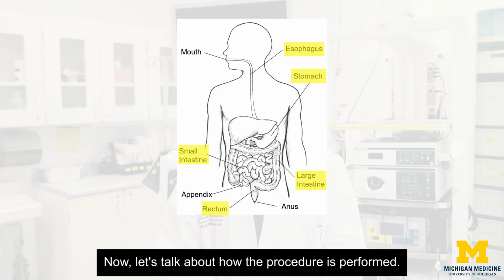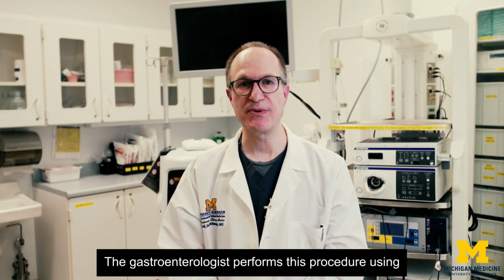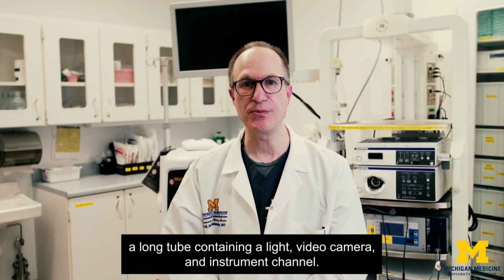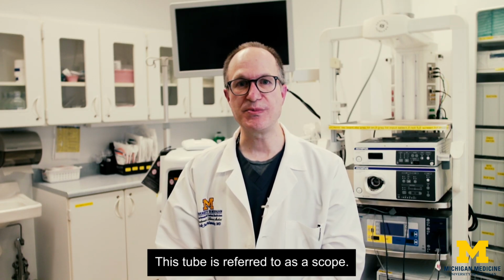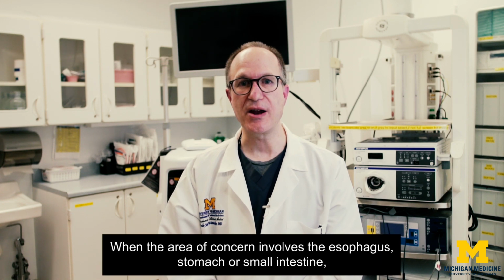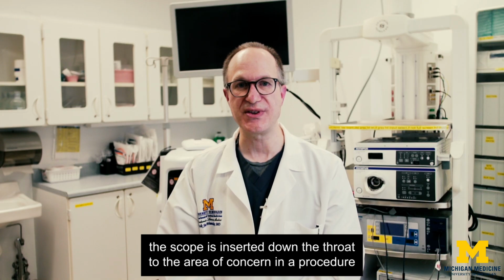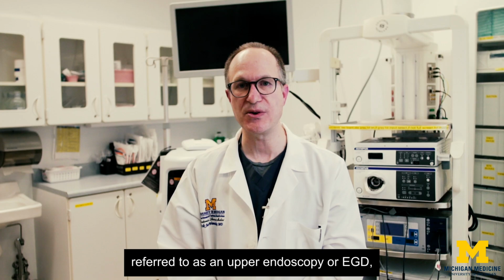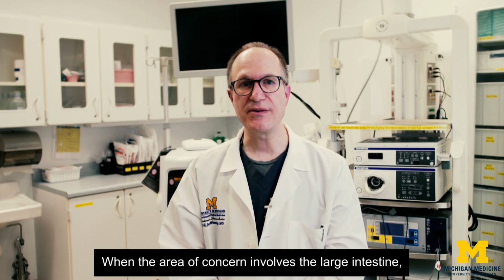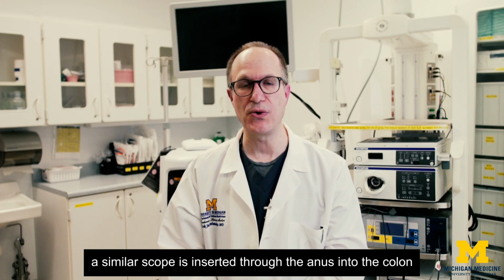Now let's talk about how the procedure is performed. Depending on the location of concern, the gastroenterologist performs this procedure using a long tube containing a light, video camera, and instrument channel. This tube is referred to as a scope. When the area of concern involves the esophagus, stomach, or small intestine, the scope is inserted down the throat to the area of concern in a procedure referred to as an upper endoscopy or EGD. When the area of concern involves the large intestine, a similar scope is inserted through the anus into the colon in a procedure called colonoscopy.